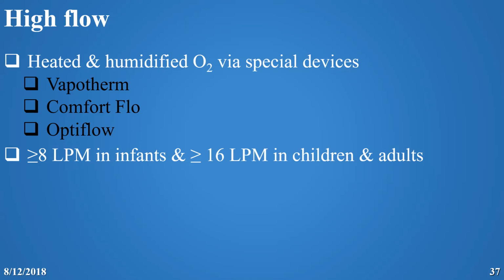When the flow is from 0.05, and some people say from 0.09 till 2, and some people say till 4, it's the normal flow. So we have microflow and low flow: the microflow from 0.01 to 0.09, and the low flow from 0.1 to 0.5, and some people say to 0.9. The only flow that does not need humidification and blending is the microflow.